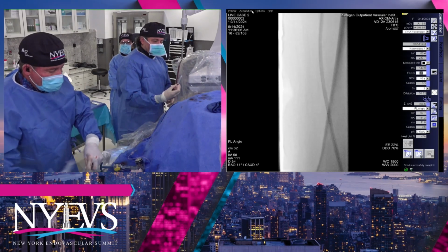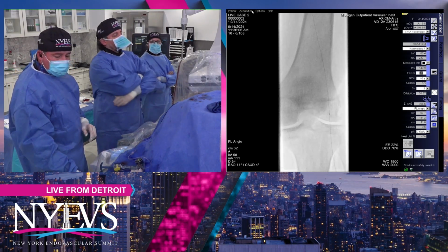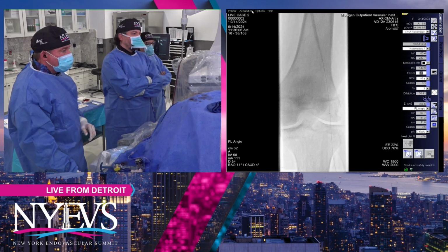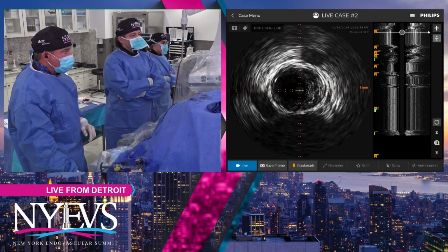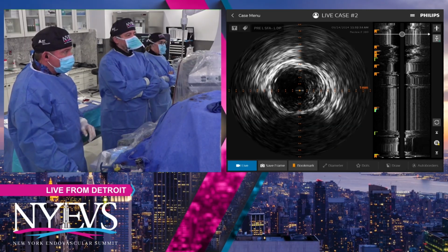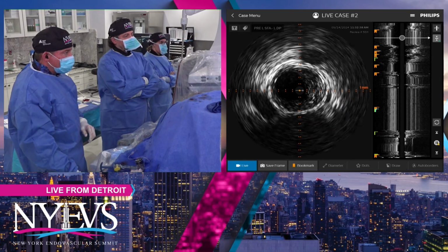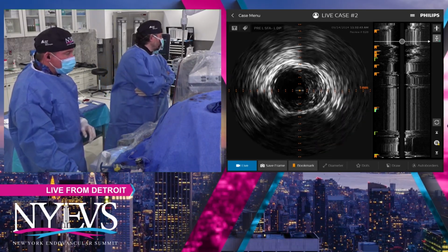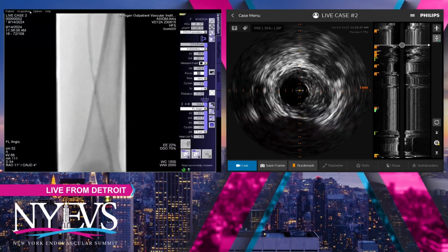Fadi, I saw that you evaluated everything using IVUS. It looked like you were sizing the lesion with IVUS. Is that your normal routine? How helpful was that to you? My second question is, it seemed like you were using orbital atherectomy, CSI, and you treated the SFA as well as the tibial. Was that largely based on the angiogram that you saw or the IVUS image?